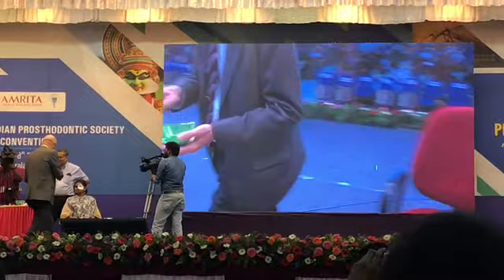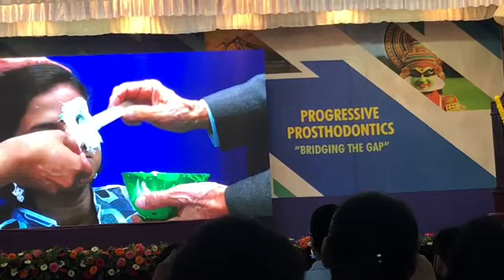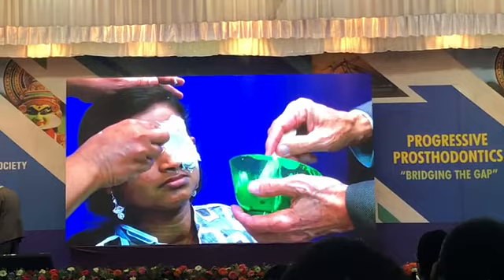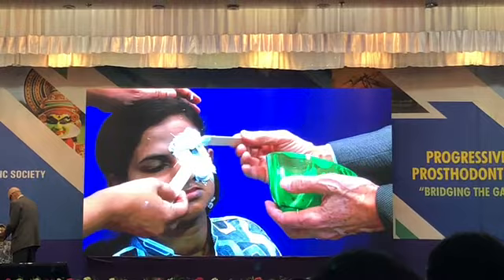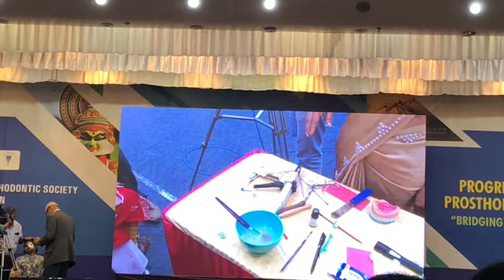So now, you can take some here too, Jacob. You apply it wherever, around the edges. Tongue blades aren't as good as a spatula, but it's okay. Give me the spatula. Where's the spatula? Where'd it go? Oh, right there. Okay, because it'll slide. Well, it still sticks.